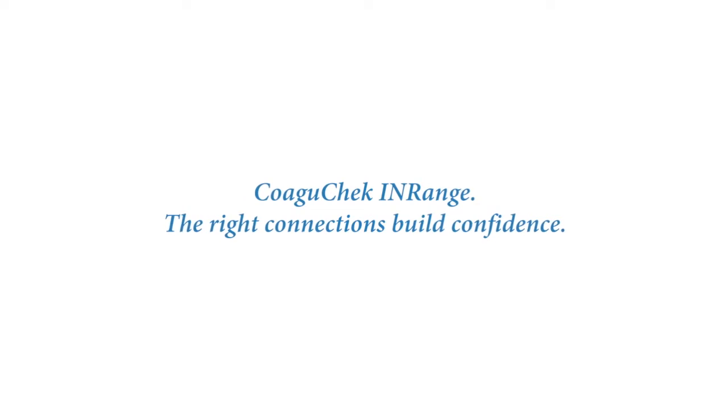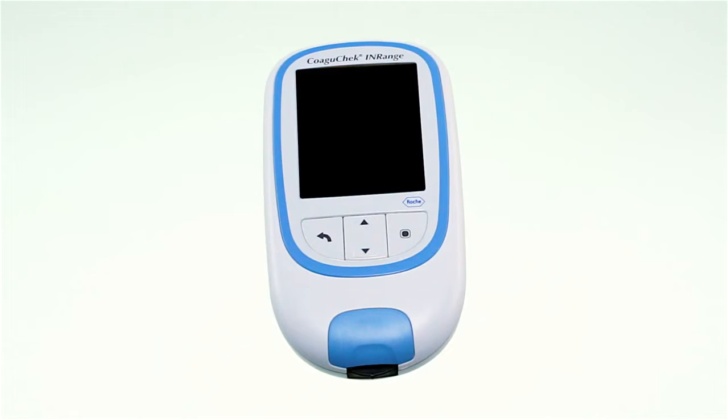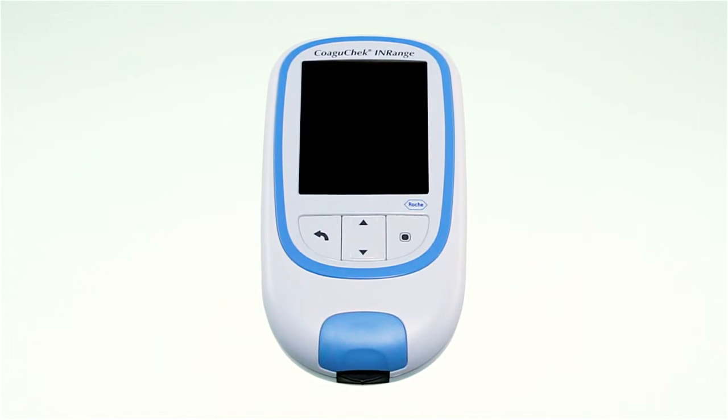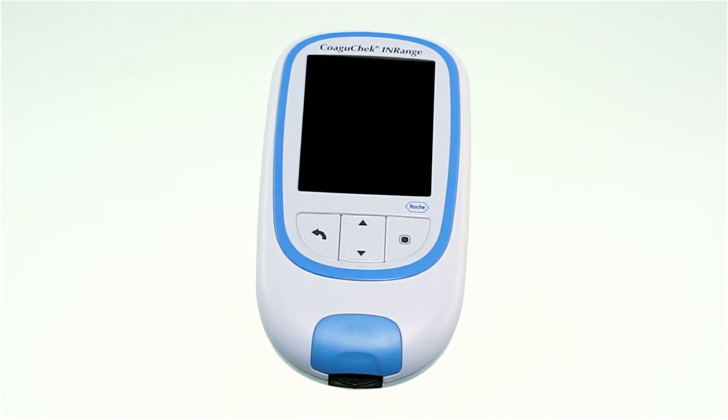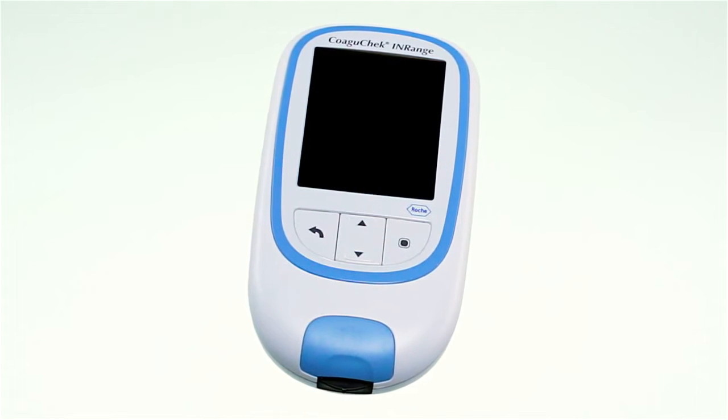COAGUCHECK INRANGE — the right connections build confidence. The COAGUCHECK INRANGE system was specifically designed to give you the confidence to self-monitor your INR and stay in range longer. This video will walk you through what you need to know to test your PT INR value.